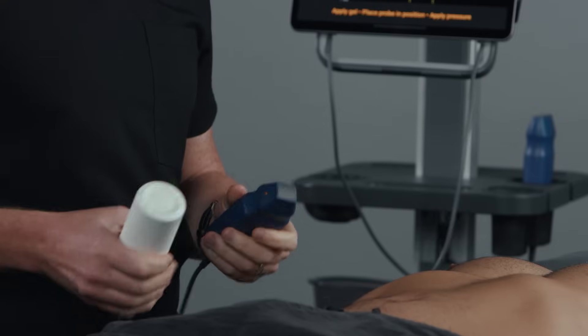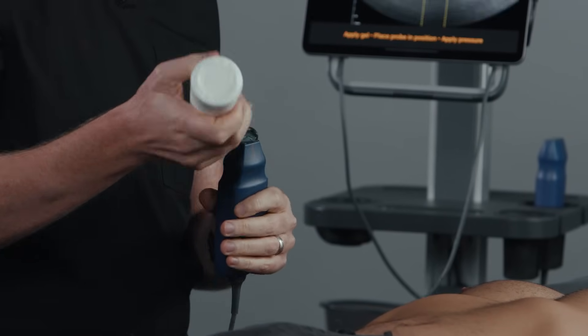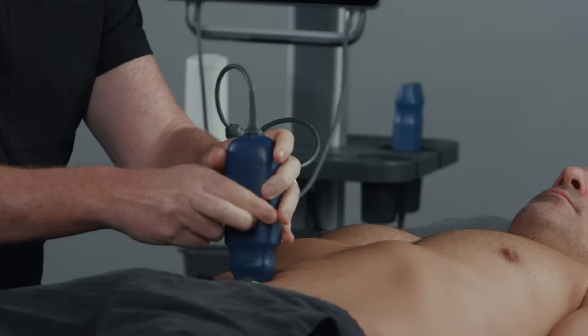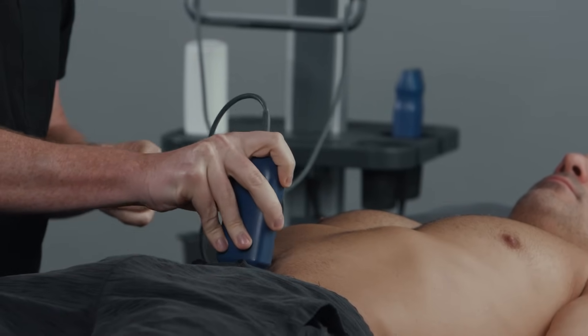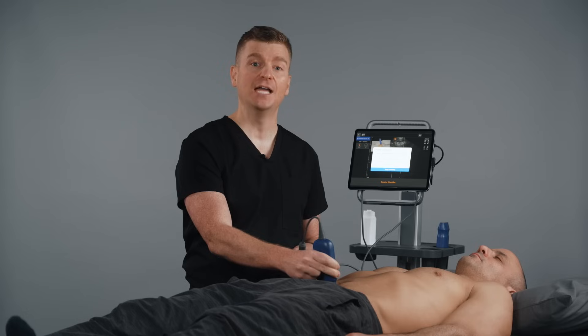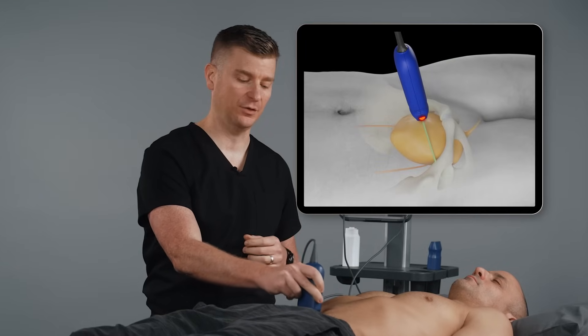Let's start with the transverse view. Apply gel to the ultrasound probe. Position the probe so that the orientation marker faces the patient's right hip. Using firm downward pressure, place the probe so that it is midline on your patient, in line with the belly button, and just above the pubic bone. Angle the probe down towards the feet so that the bladder comes into view.